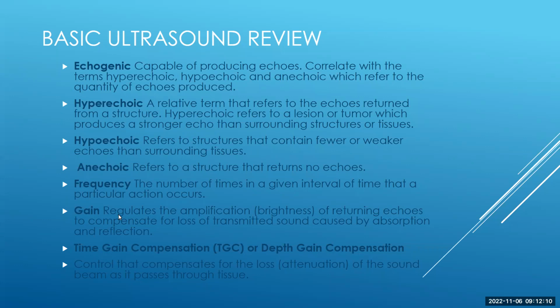Versus as you increase the gain, you brighten everything out, and it's really going to start distorting the image a little bit. So it's a fine balance between increasing the gain to have amplification, where you can see your needle, for example, better, but you're going to lose some of the details of the anatomy differences and tissue planes as we go too much with that. So be cautious with gain. It can distort your image a little bit.